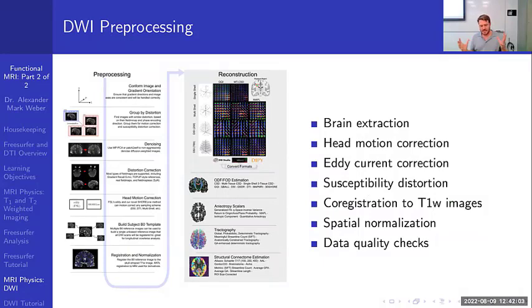So the thing is, diffusion weighted imaging comes with a lot of messy data, and we're going to try to clean it up. So that's what the first step is. We're going to have to pre-process our data, just like we did with fMRI. And so the artifacts in diffusion weighted imaging are mainly related to these gradient systems I introduced, but also the sequence acquisition strategy and motion, again, motion.